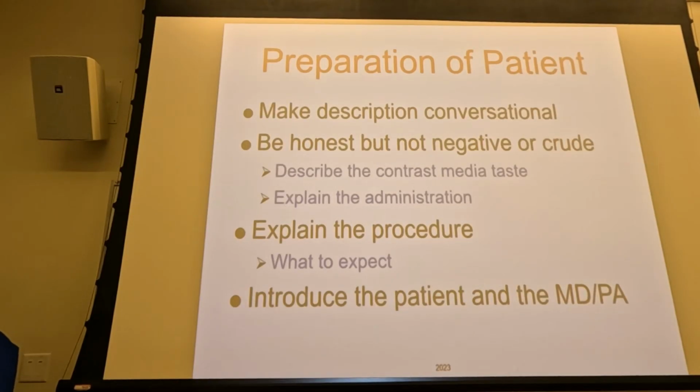So preparation of the patient. Try to make the conversation with the patient and the description of the exam that you're going to do conversational, right? Don't get overly specific with the patient, and this applies to pretty much every exam that you're going to do. If you get overly specific and overly technical, the patient has no idea what you're talking about, especially if it's an older patient. So try to make it relatable to them. We're going to have you drink some stuff. It tastes terrible, but it's important that you drink it as fast as you can so that we get a good study. You go in and say, we're going to give you some orograffin, and start describing and naming names of the contrast type, and you're going to lose your patient, right?